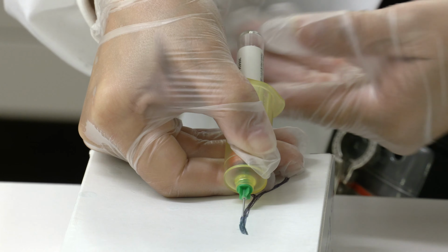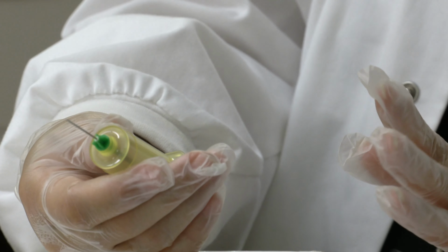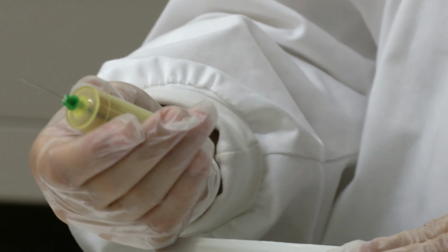If you're not in, then you're going to have to get rid of this lab tube because the vacuum has now been released and it no longer is good. So you have to start all over again. That's why people who have been doing this for a long time will end up using it, but otherwise, new people, I'm going to show you a better technique.